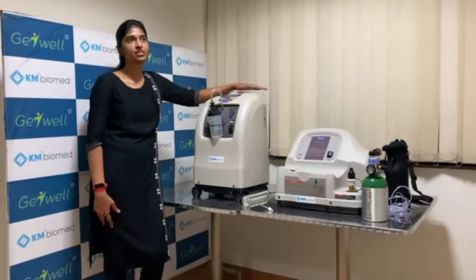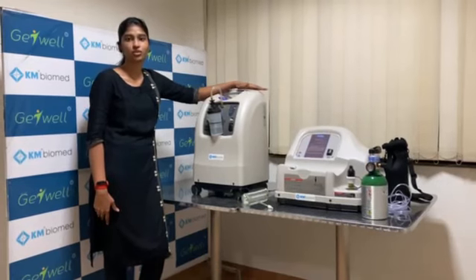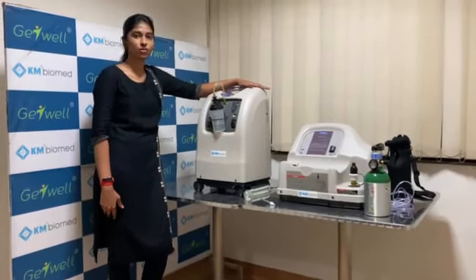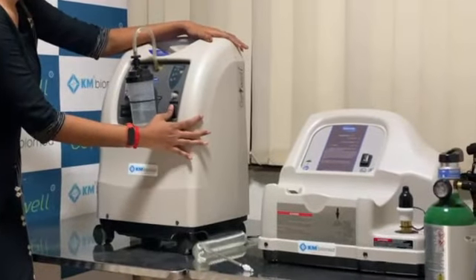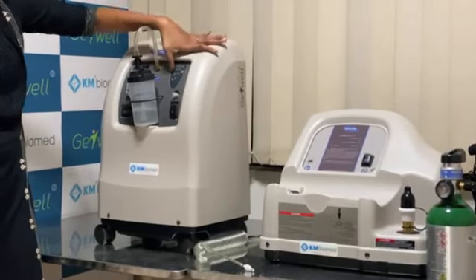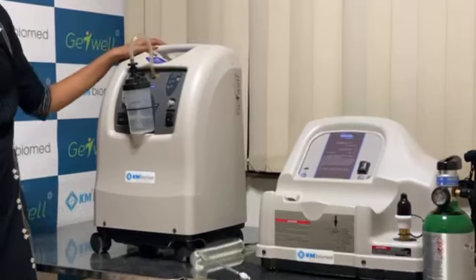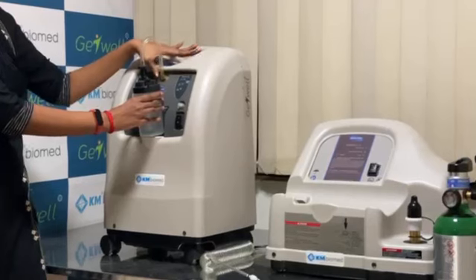Nowadays we are facing a lot of oxygen shortage in our country, and people are even dying due to oxygen shortage. To prevent this, we have a solution — we have an InvaCare Oxygen Concentrator. Once we switch on, we will get an alarm in less than a minute, and then we have a green light near the O2 symbol, which indicates that oxygen is being delivered through the oxygen outlet.